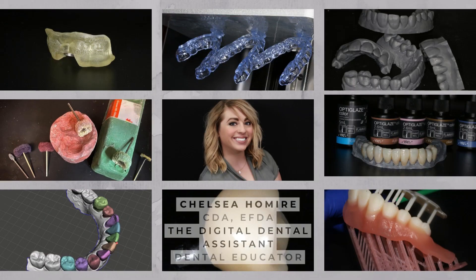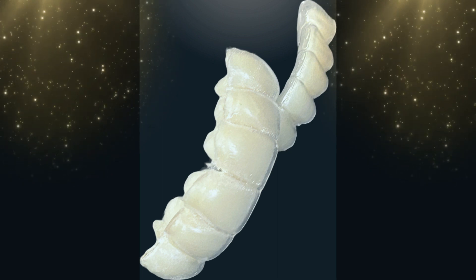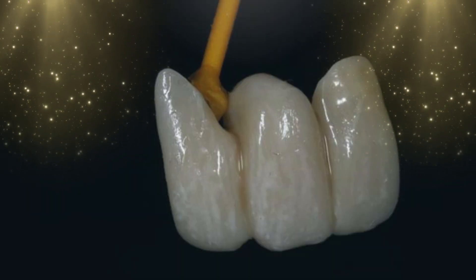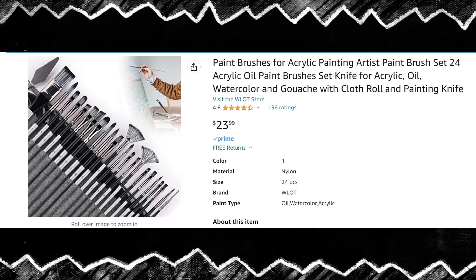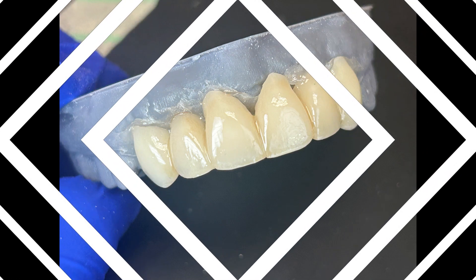Chelsea Holmeyer here and we're going to go over some OptiGlaze — a quick video on how you can go from a plain 3D print to something really pretty as a temporary or your final restoration. We'll go over my likes and dislikes. This one actually matched the patient's surrounding teeth perfectly. I like to use the OptiGlaze kit, and I ordered my brushes on Amazon — I didn't like the brushes that came with it. Don't spend too much, but don't get the cheapest of the cheap.